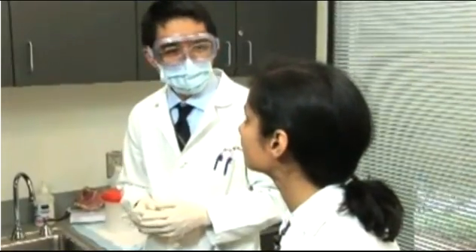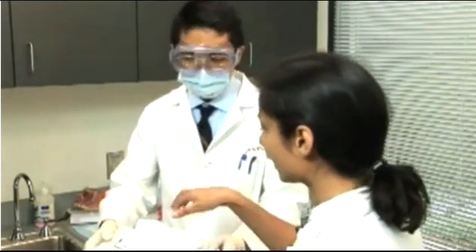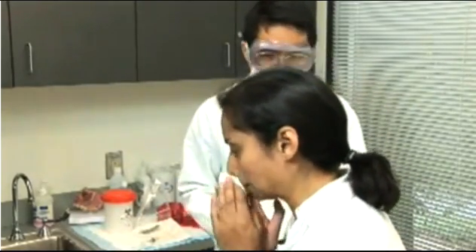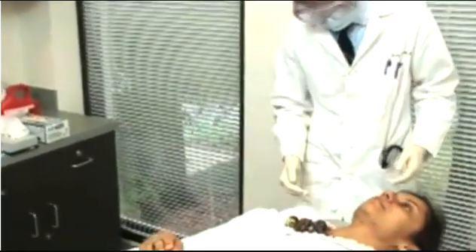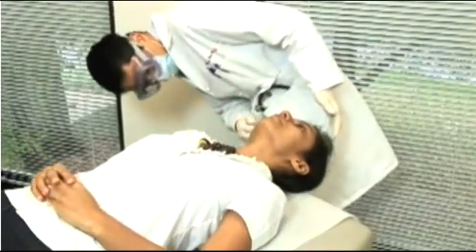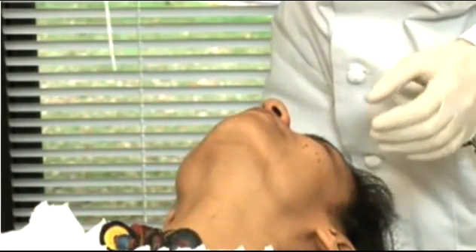Before you begin the procedure, ask the patient if he or she has a deviated septum or nasal obstruction, and have them blow their nose to remove any excess mucus from the nasal cavity. The patient should be in a supine position for specimen collection. The patient's head should be tilted back with their neck extended to allow for the pooling of the aspirate in the nasopharynx. Instruct the patient to hold their breath and not to swallow during the procedure if possible.